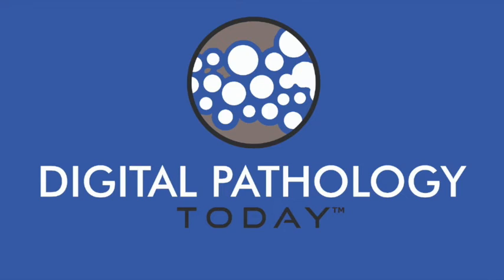That has allowed us to use features or attributes that could be gleaned with image analysis to then help prognosticate outcome and predict therapeutic response. Now, when we think about machine learning, a large part of what is happening in machine learning today is what is called deep learning, with the use of neural networks to analyze images. The challenge with deep learning, of course, is these approaches generally tend to be fairly opaque. They're, for better or for worse, they tend to be labeled as black box approaches.